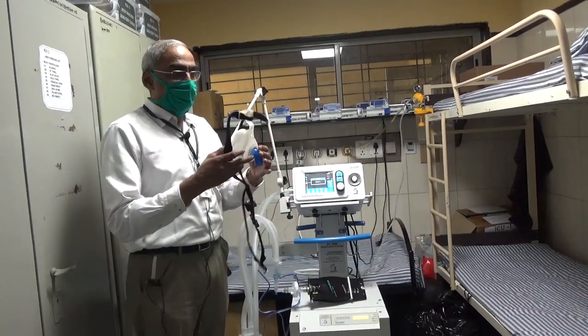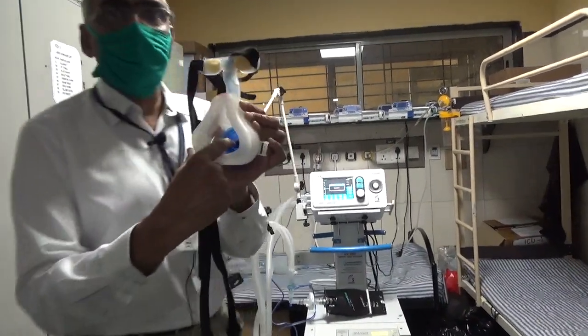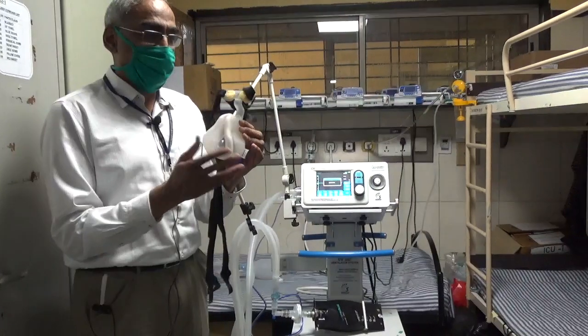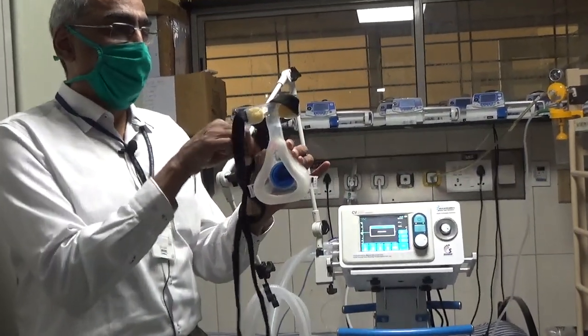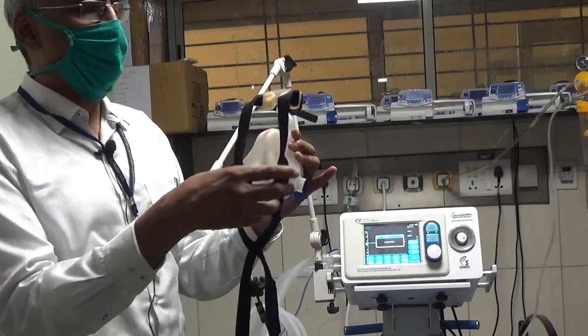So this is the mask, and I can show you that this mask, the valve is usually in this place. That valve is not there in this mask. So there should be no valve in the face mask. You can see that it's a soft material that fits snugly on the face. Then there is this strap, and there are these sponge pads to make it comfortable to wear.